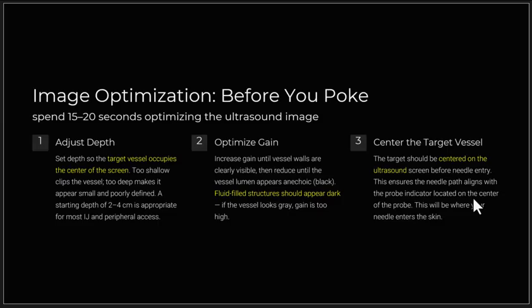You also want to optimize your gain so that it's not too bright or too dark, but such that you can see that vessel, that fluid-filled structure. It should be dark on your screen without too many bright echoes inside. If the vessel looks too gray, then the gain is probably a little too high and you need to turn that down just a little bit.